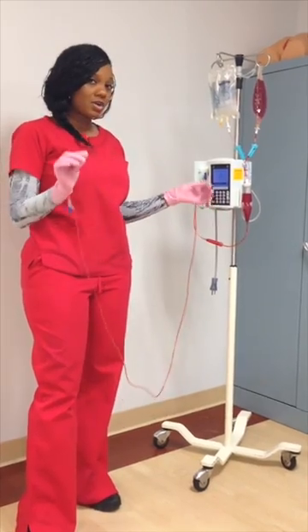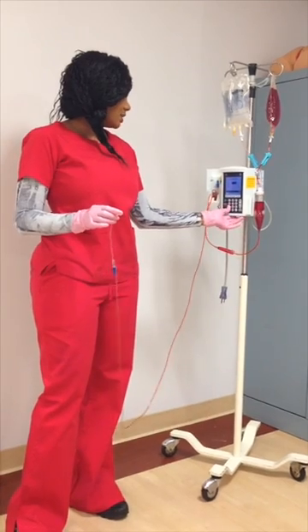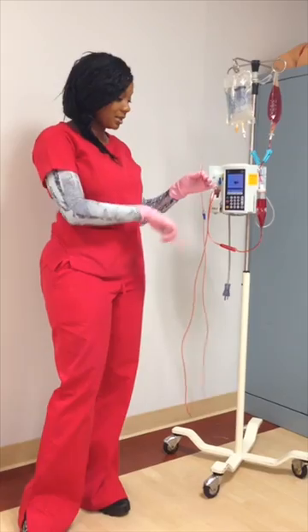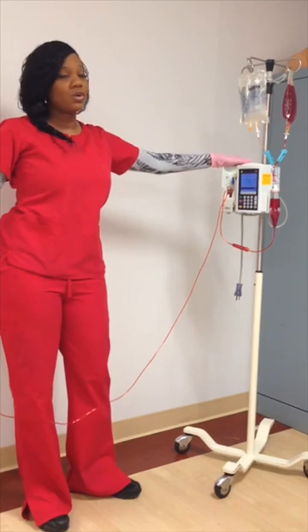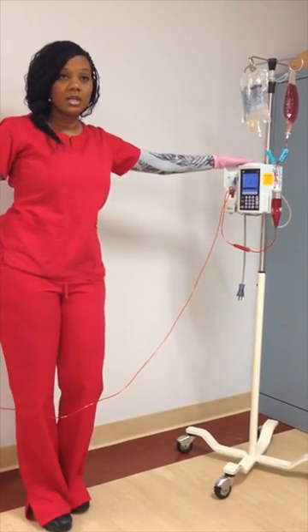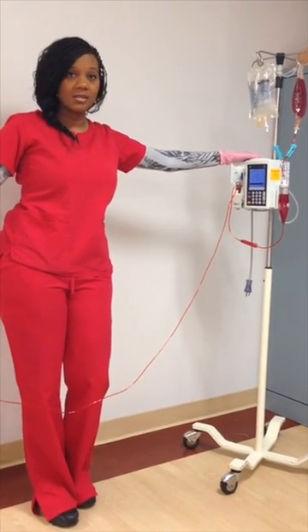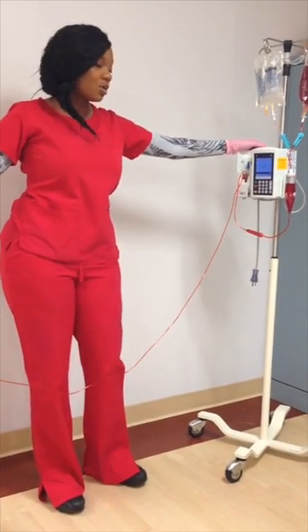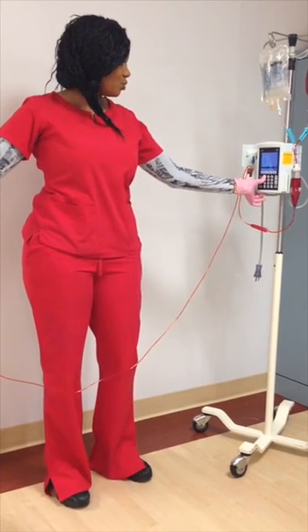After that, connect everything to your patient. Start your transfusion at 75. Keep in mind this is already primed and connected to your patient. You are to stay in the room with your patient for about 15 minutes, noting any reactions and any changes in the patient's status. Once you meet your 15-minute mark, you can go ahead and increase your rate to 125.